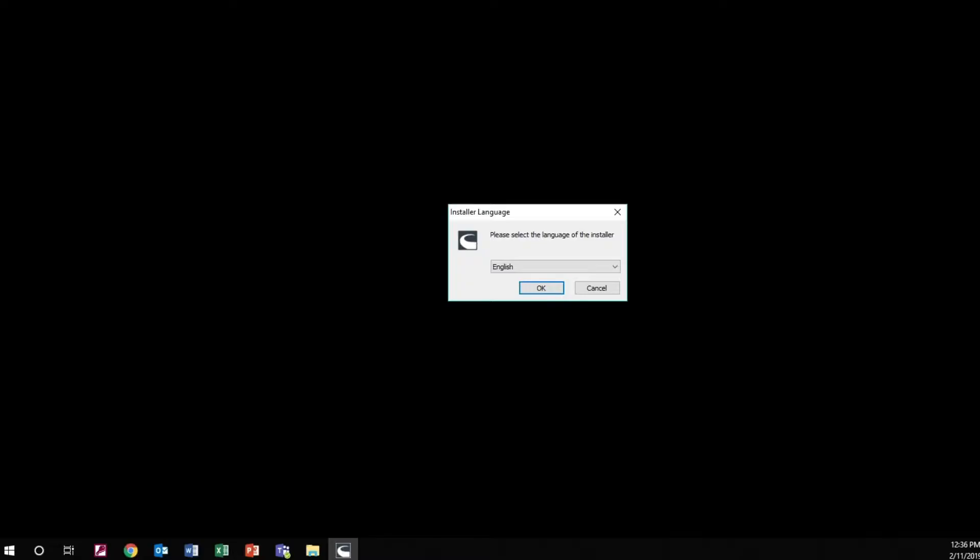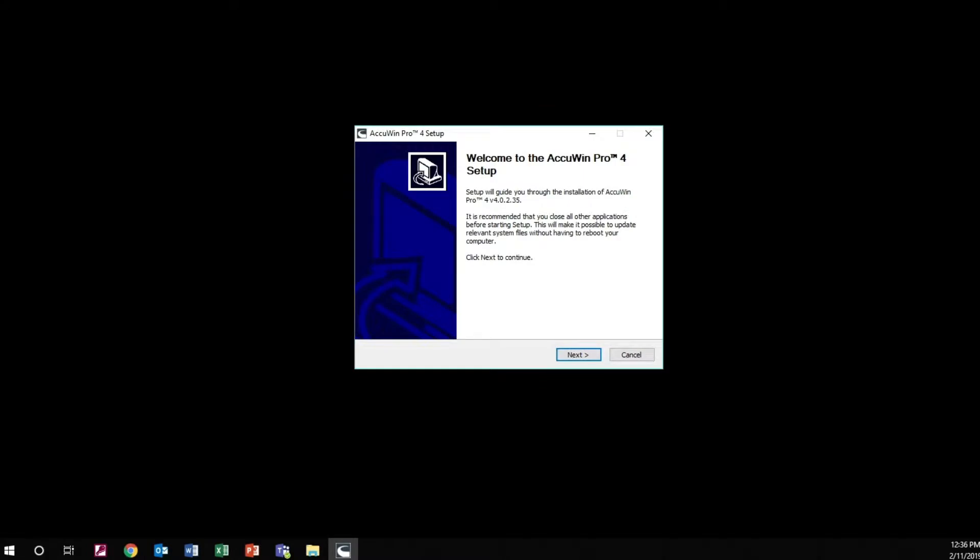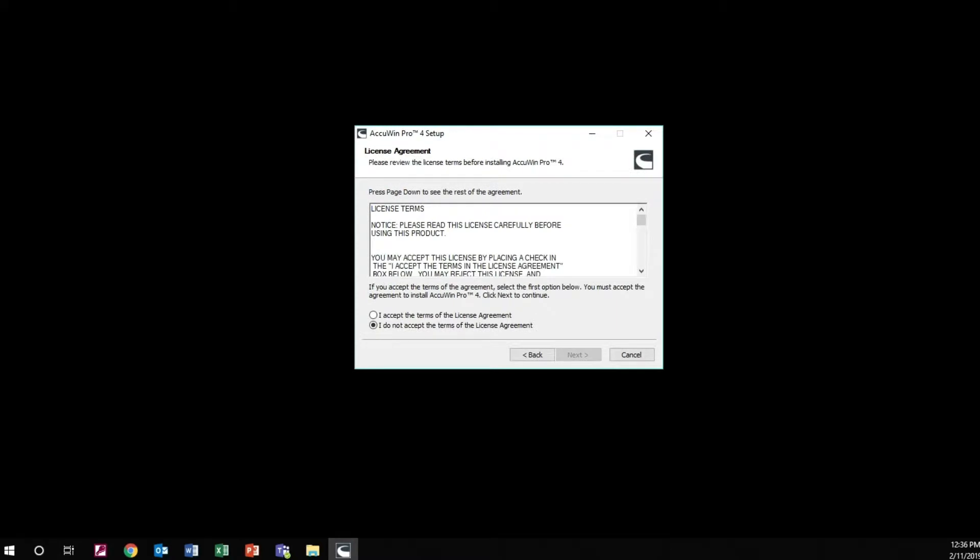Select the language of the installer. The AccuWin Pro 4 setup window will appear. Click Next to continue the installation.